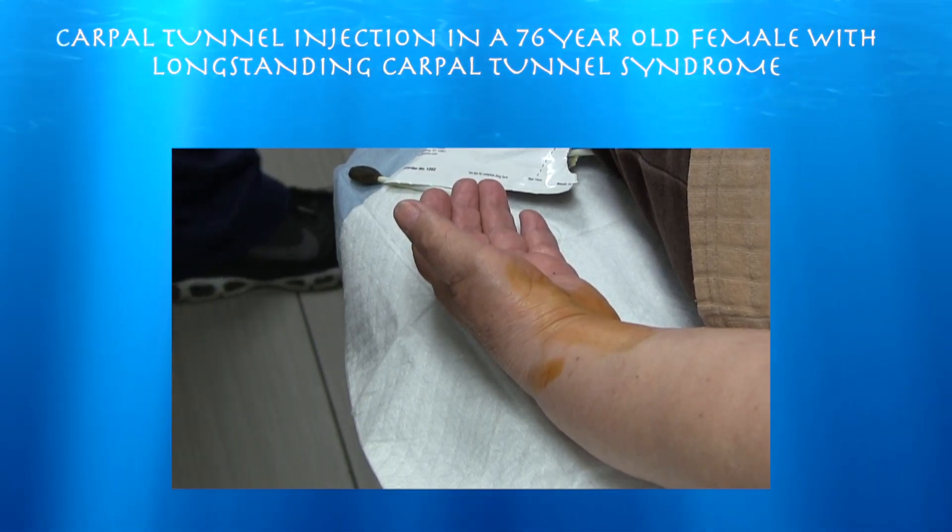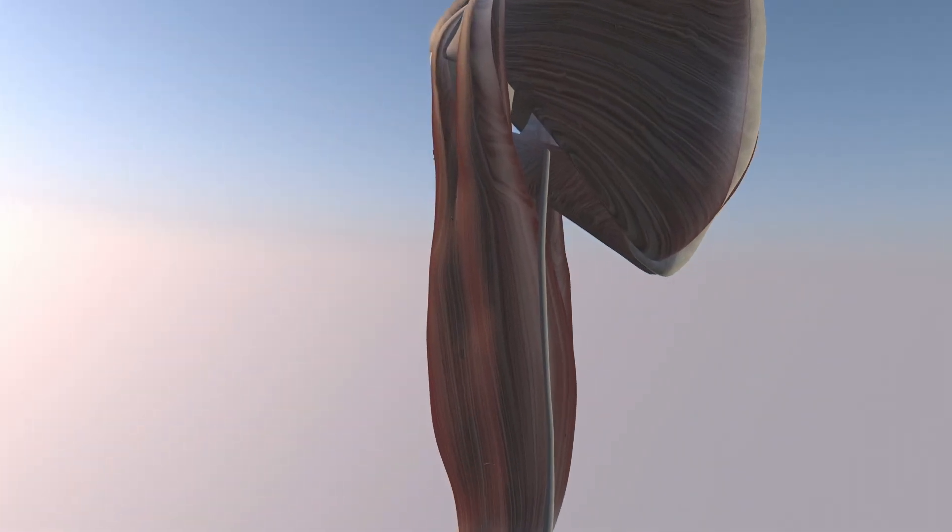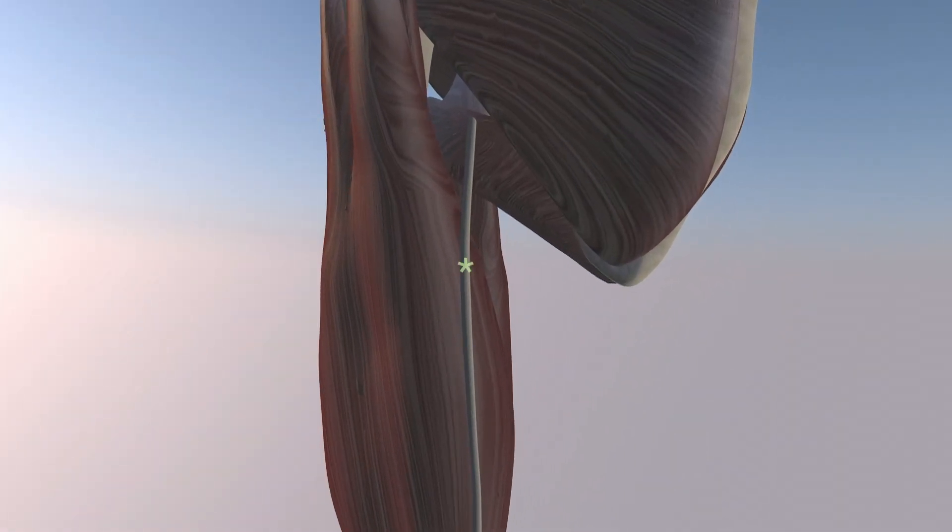76-year-old lady with long-standing carpal tunnel syndrome. Here we're going to run through the anatomy of the median nerve, which you can see here with the asterisk right above it. That's the short head of the biceps muscle that it runs just medial to.